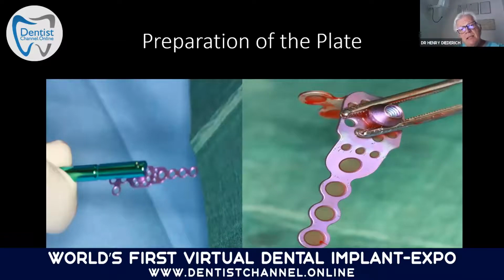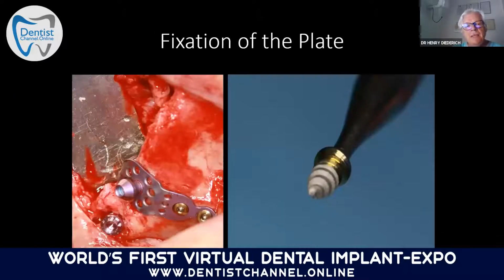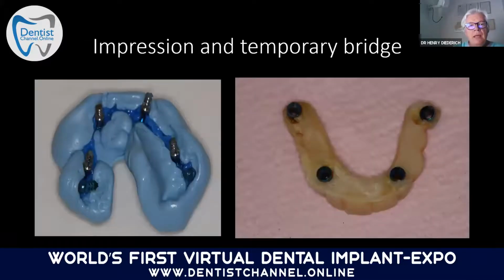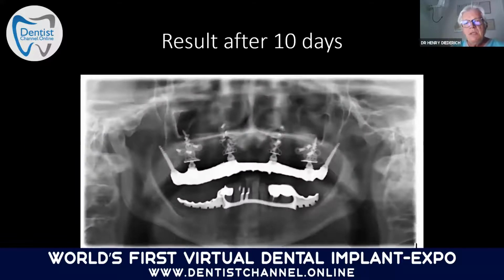On the left side, it is delivered like this, and it is like a device made to measure. You see, adapted to the bone. You may bend it, and then it is fixed on the bone. You see here the protocol: pterygoid implant, plate, and then the screws. The different plates, HENGG-2 and HENGG-1. And the impression is done immediately after the surgery. We are doing a temporary bridge. And here in this case, the finished bridge was settled already 10 days later, but for financial reasons, we did here a metal acrylic bridge. But here you see the result after 10 days.